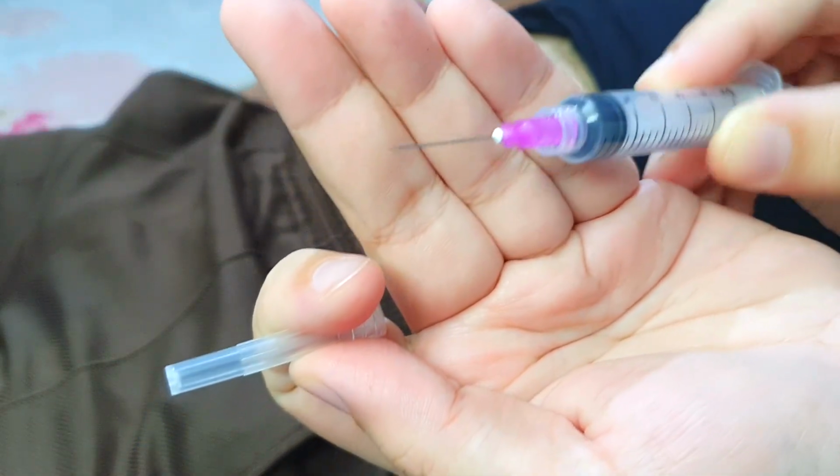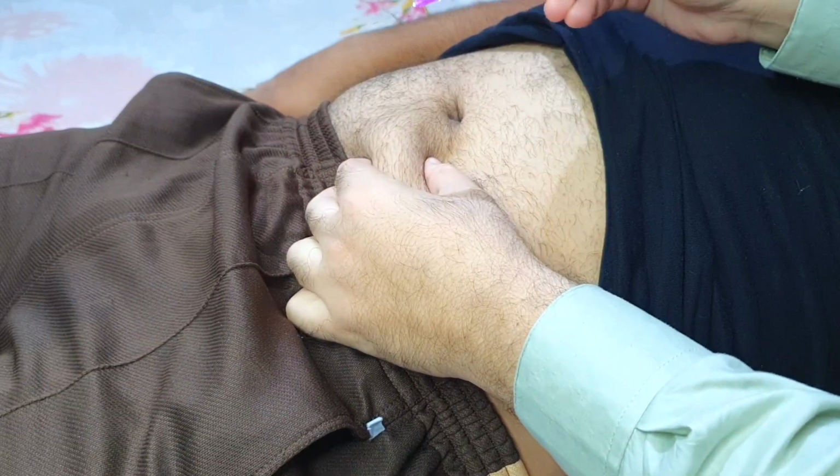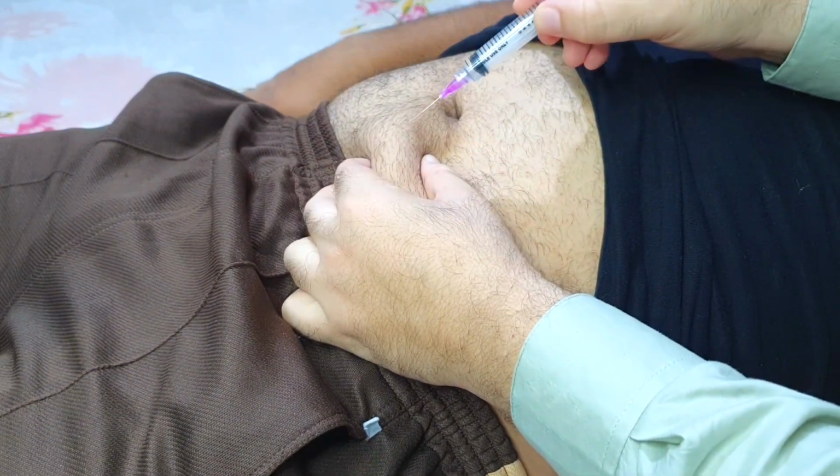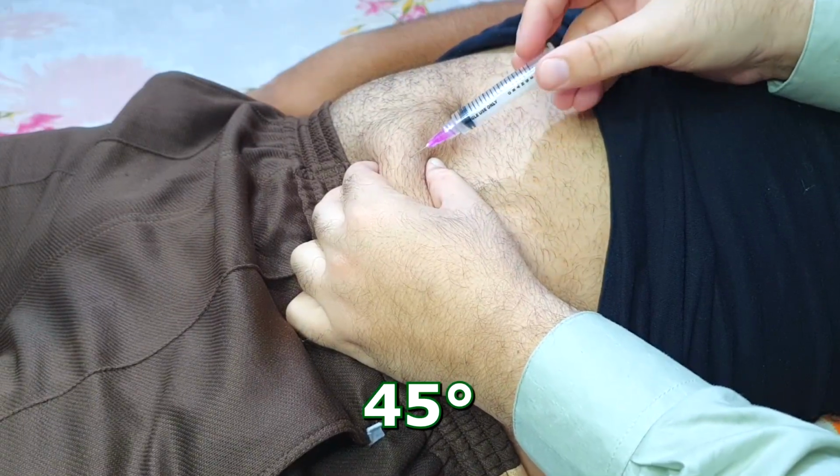This is the 5 ml syringe that I will be using now for my second demonstration. You can see I have not selected the exact same area again and changed the location a little bit this time. Pinch the skin, insert about half the needle at 45 degrees, inject and then withdraw the needle.